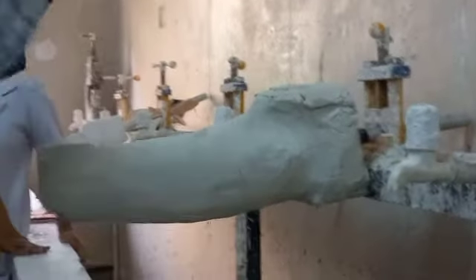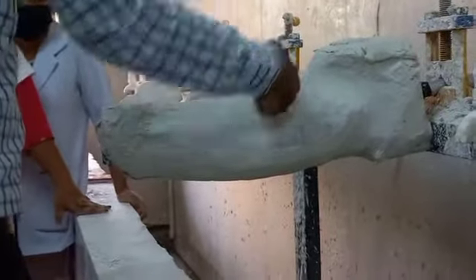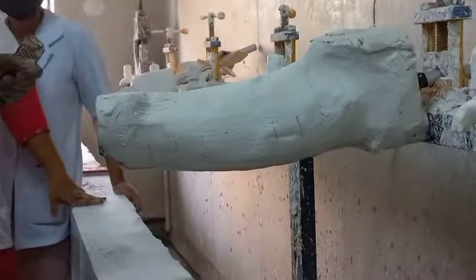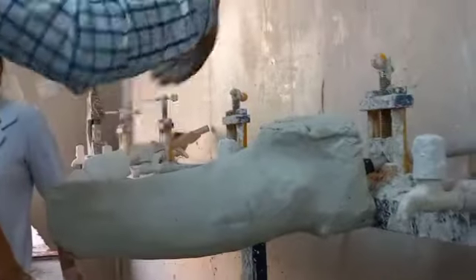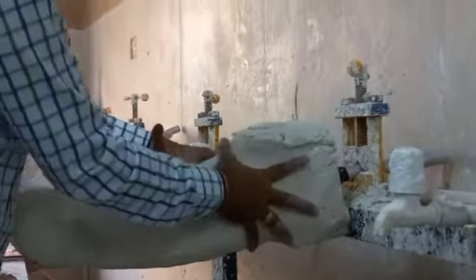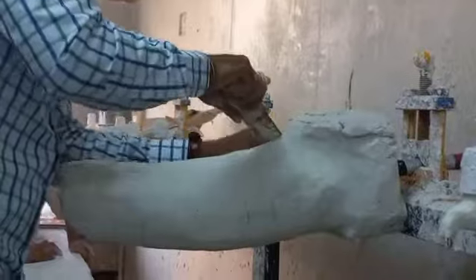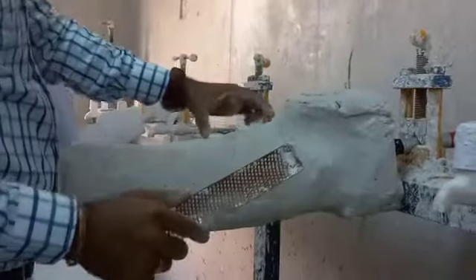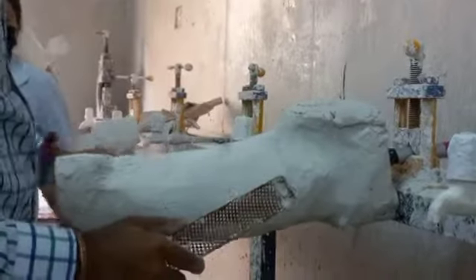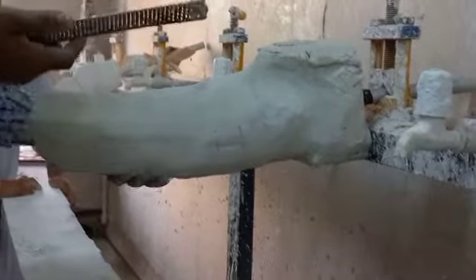To create a brim. So if we can create a brim with an opening on the posterior side, he can easily push his leg into this brim, so that this area is loaded. For that reason we require this measurement, right? So definitely you have to get the measurement at least up to this area. We need the measurement. After that, because we are opening it, we need not have any measurement in this area.